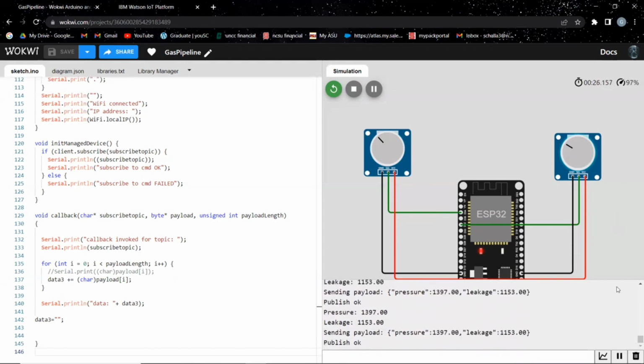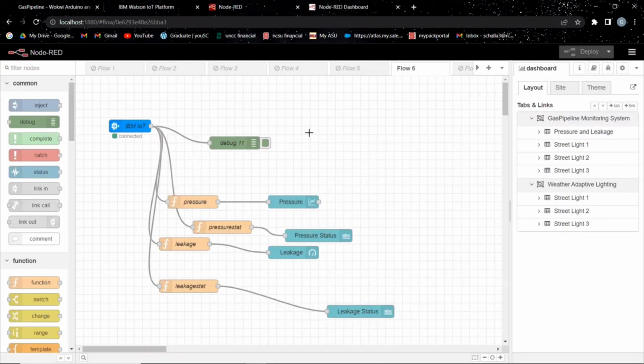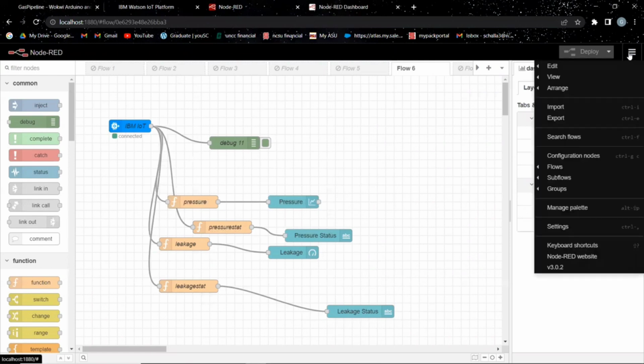So we have seen the change in values, and these same values are sent to the cloud platform. So now we are done with the Wokwi interface. Let's start with the flow diagram. You will first be required to add nodes. For that, you have to select the drop-down menu on the top right corner and select the Manage Palette option.